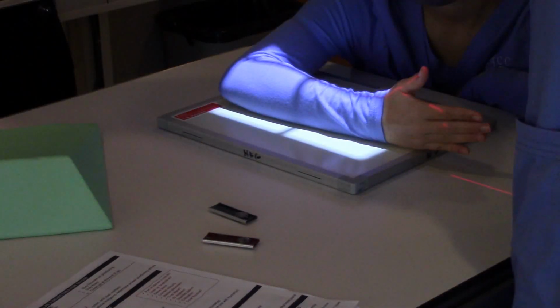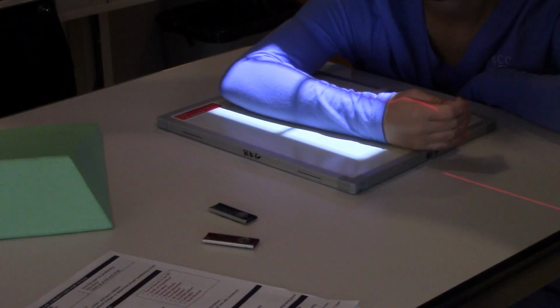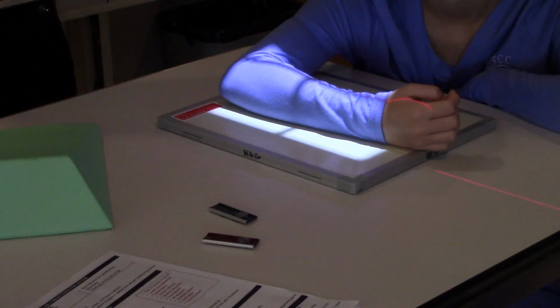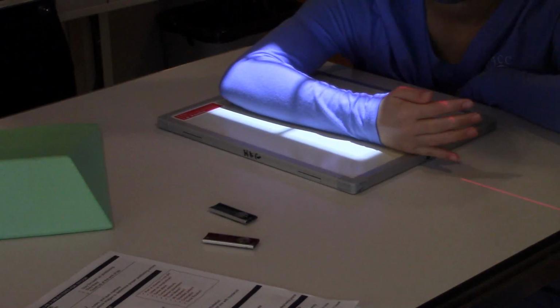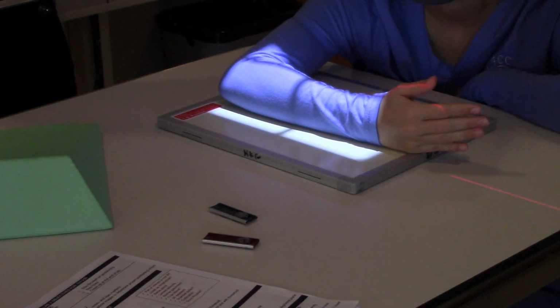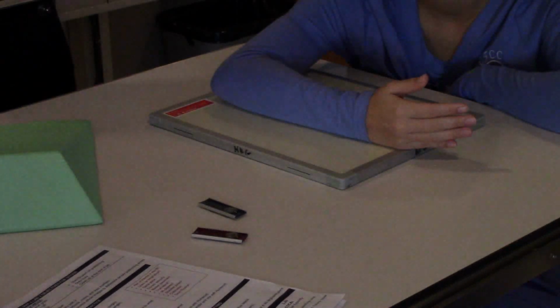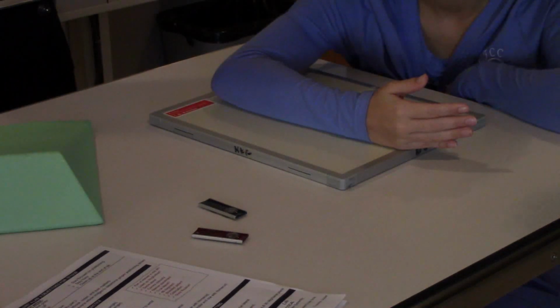All right. That tube, oh, I see what it is. Your tube's in detent to the table. That's the reason it's being such a problem with moving. We've got it stuck in detent. Since we're having such a problem moving the tube, let us do something like this and just float the patient around a little bit.